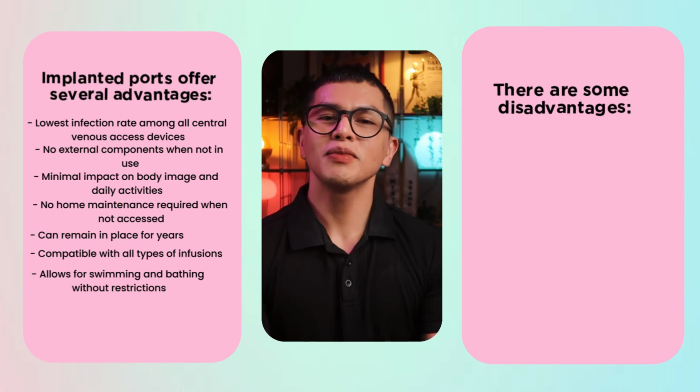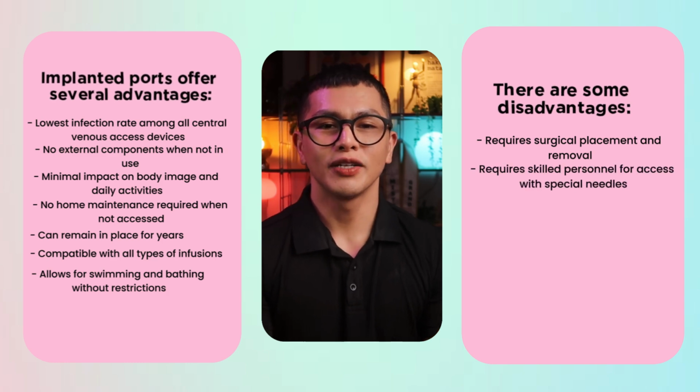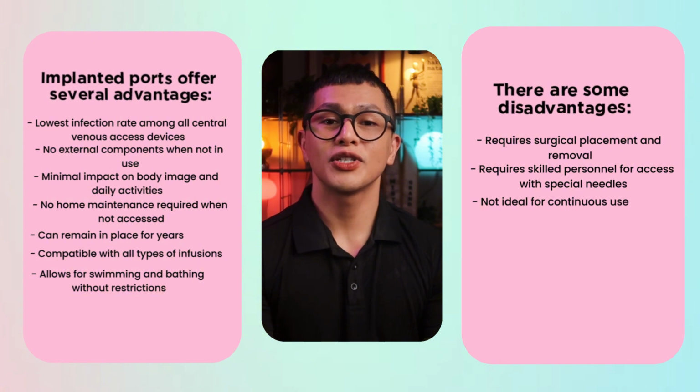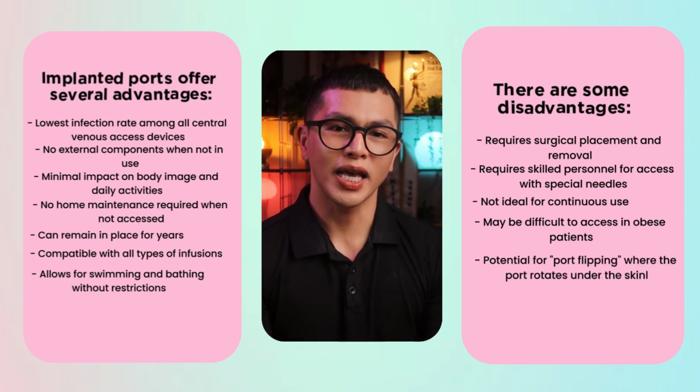However, there are some disadvantages. This requires surgical placement and removal, requires skilled personnel for access with special needles. This is not ideal for continuous use. This may be difficult to access in obese patients. Potential for port flipping, where the port rotates under the skin.